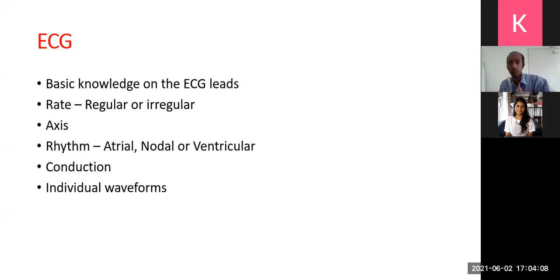Okay, fine. Right. So let's start with ECG. As we go on, if you have any questions, comments, problems, please put it on the chat. This lecture is going to be structured based on these 6 points.